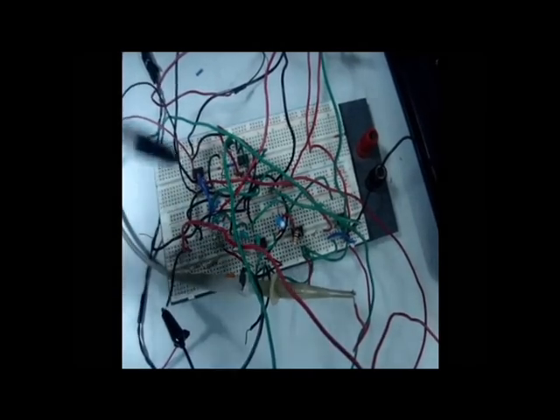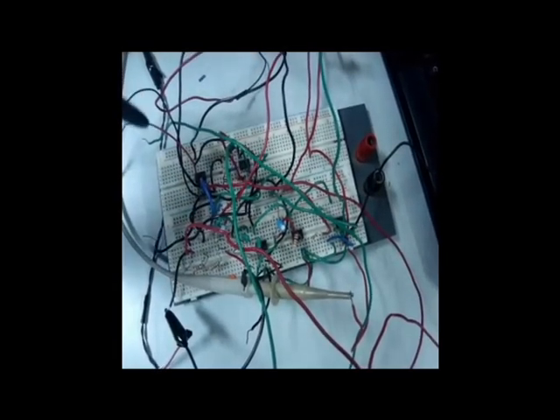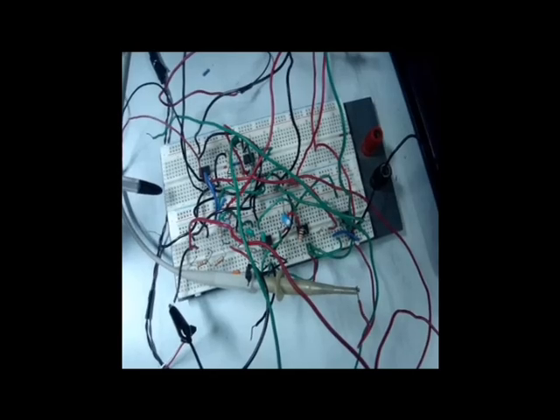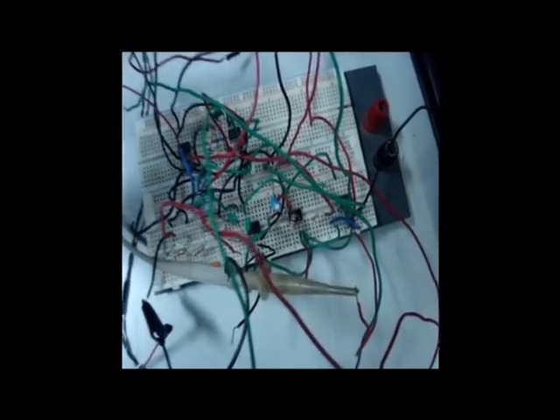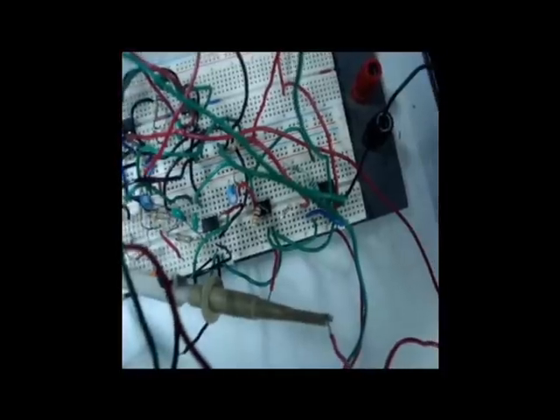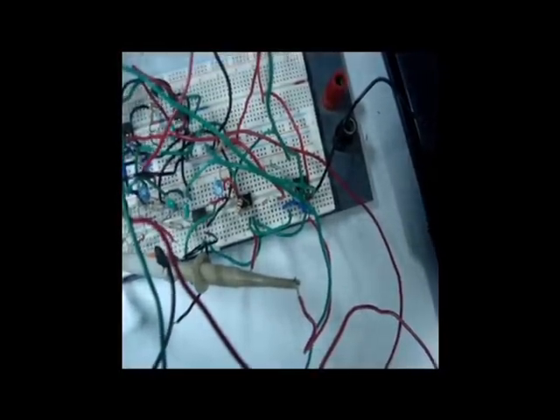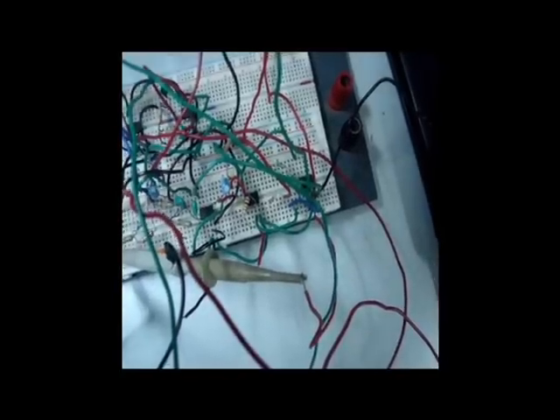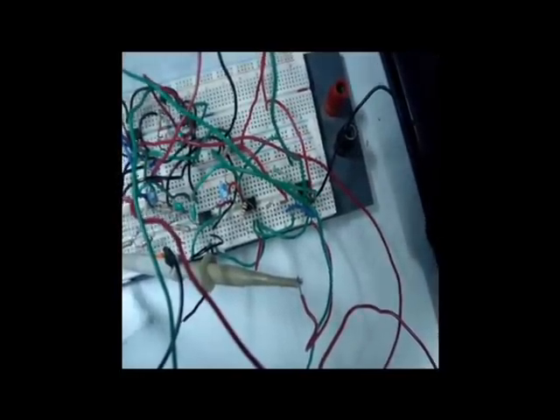This is amplified by using a non-inverting amplifier of gain approximately 50, which makes the amplitude of our AC signal around 400 millivolts peak to peak. Since we have to sample this AC signal, we have to shift it to a positive level. For that we use an adder circuit which adds around 1.2 volts to our waveform. The output of this adder circuit is a PPG waveform which can be utilized for calculation of results.